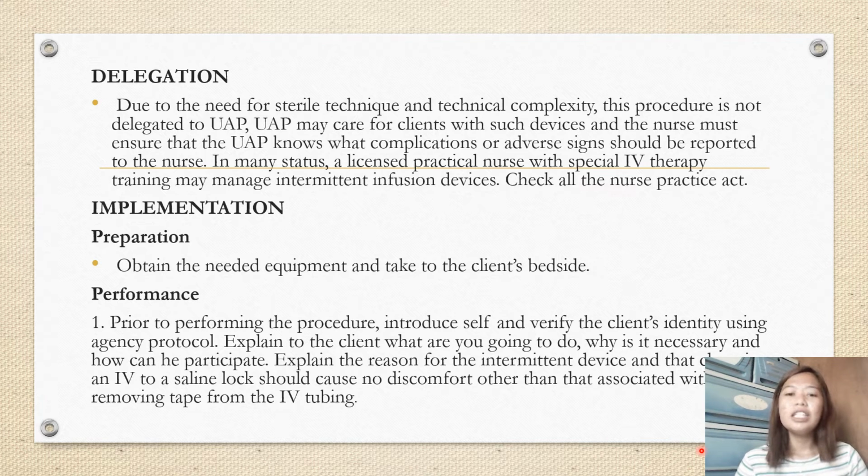Tapos, syempre po, permi pong itatanong kung sino sila, kung ano yung pangalan nila, tapos yung birthday nila. Sa mga hospital, ito ang ginagamit na pag-verify ng patient. Then, explain. Bago kita magpuno ng maski anong procedure na gagawin ta sa patient, sasabihin ta sa kanila kung ano ito para aware sila and makaka-cooperate sila.